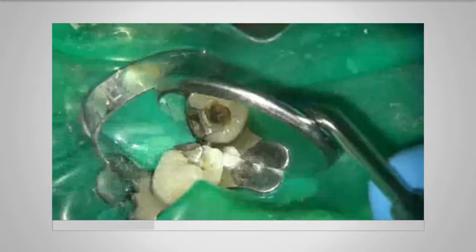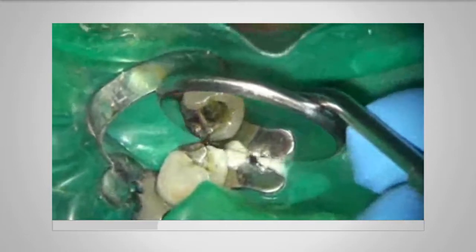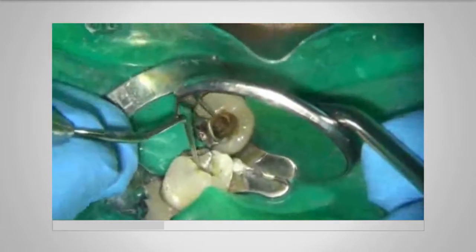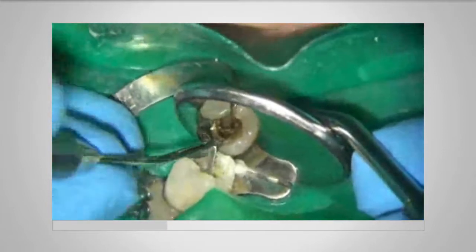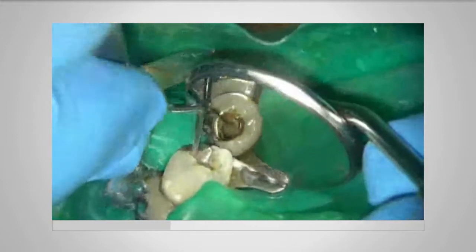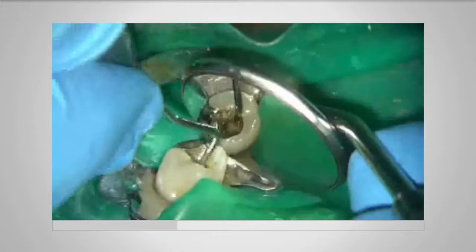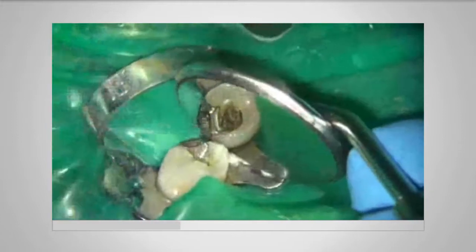Looking down inside with the microscope, and start to visualize the head of the broken instrument. Now this is set Endomethasone paste that's in the root canal there. I'm going to irrigate with some sodium hypochlorite.